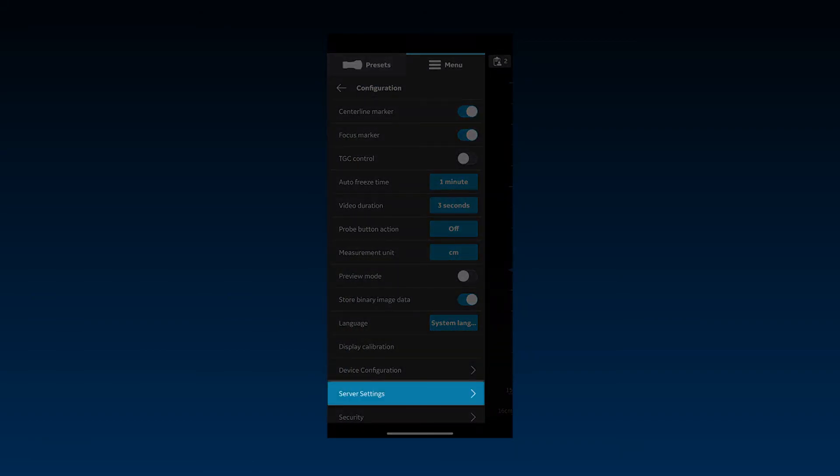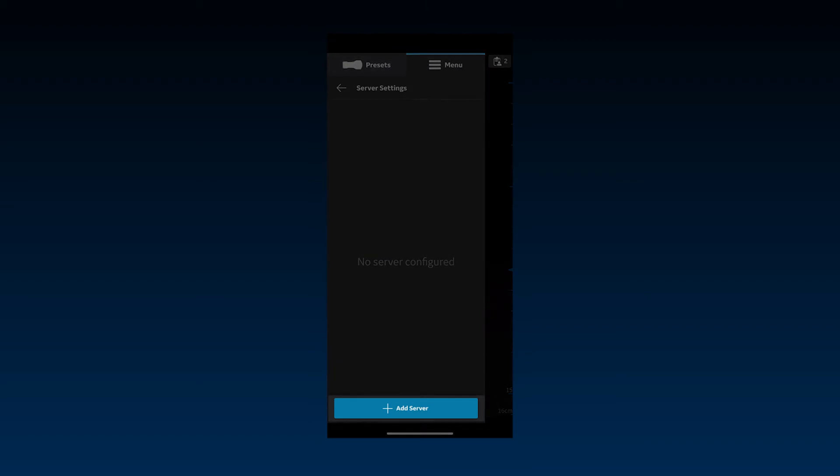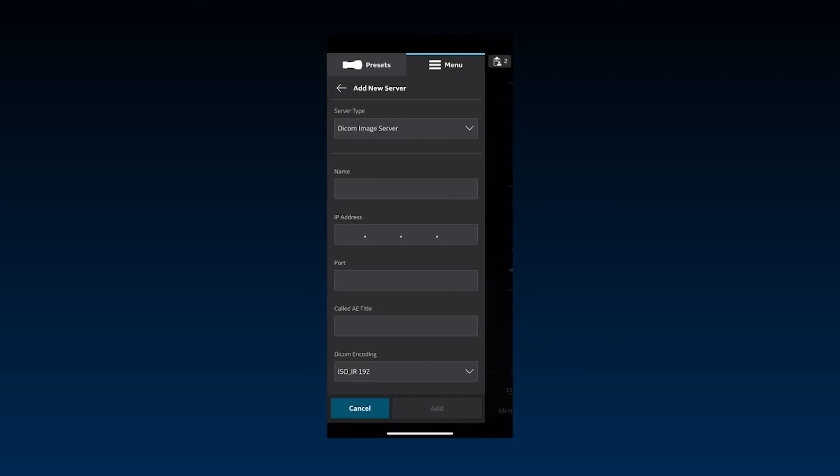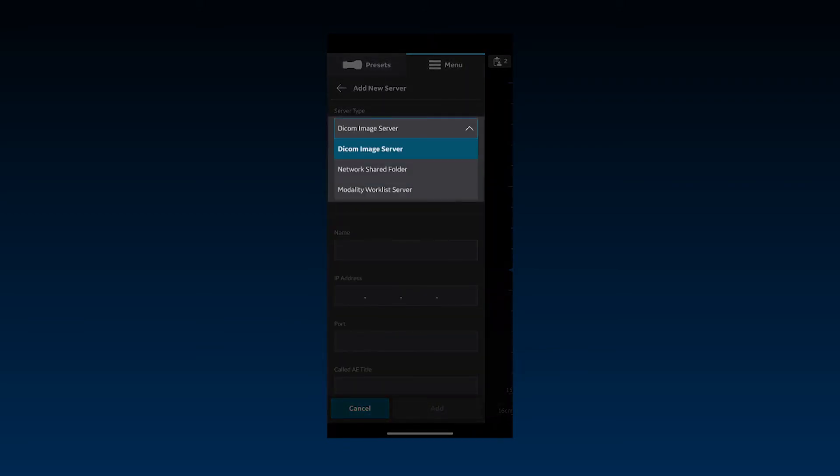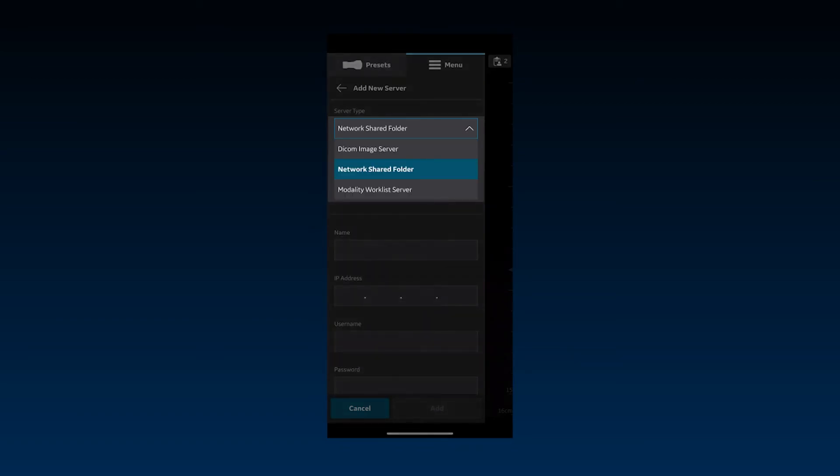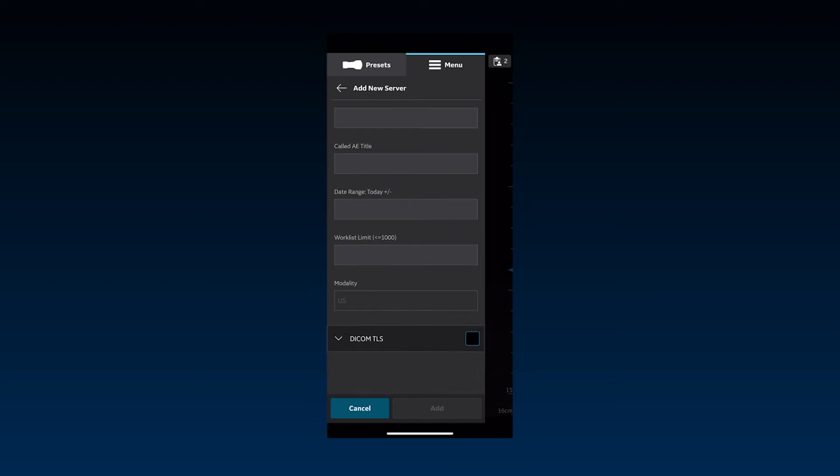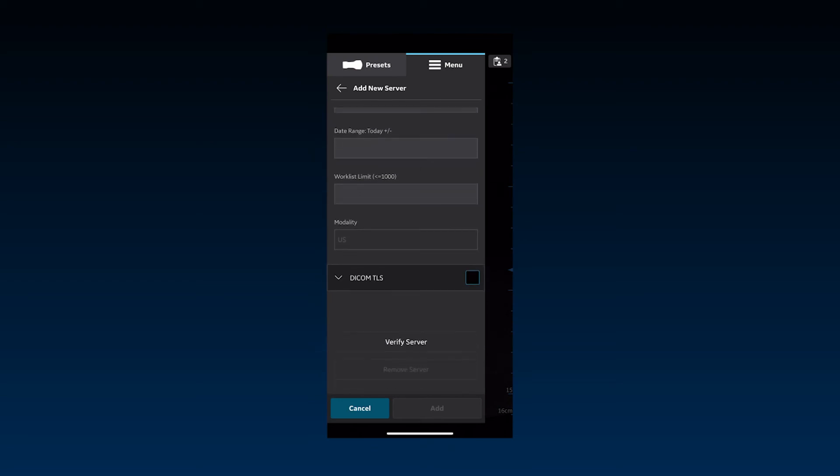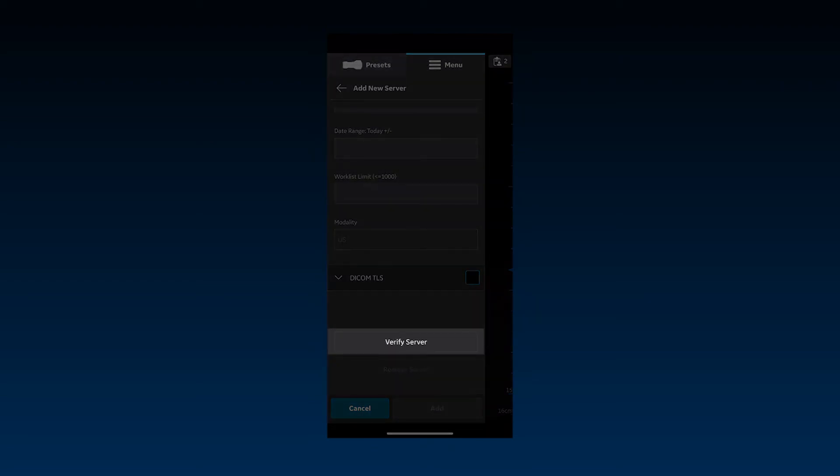Server Settings is used to configure and add a new image storage server or a DICOM modality worklist server. vScan Air supports image export to DICOM image servers and network shared folders. The available fields for necessary information are updated according to the type of server selected for configuration. A successful connection can be verified by pressing Verify Server before saving the new server details.